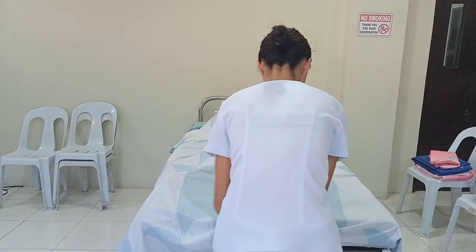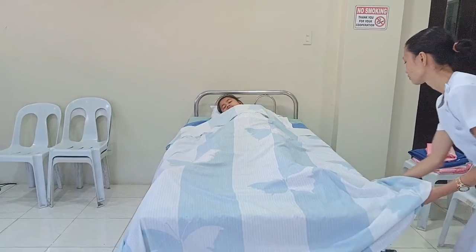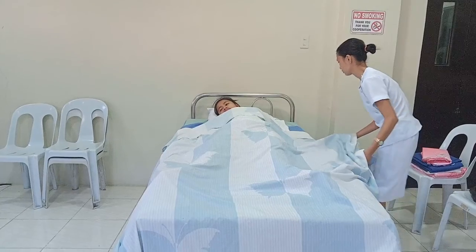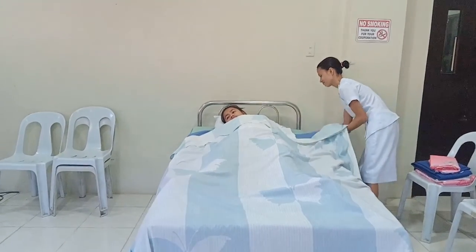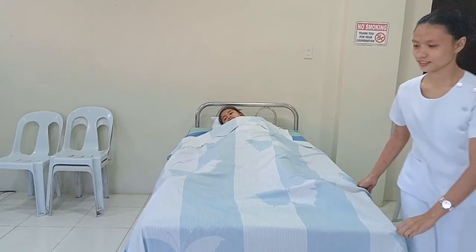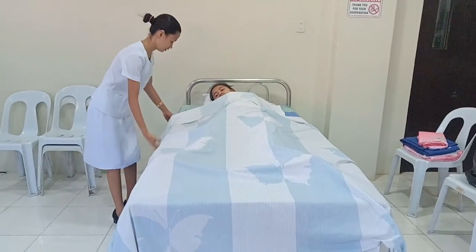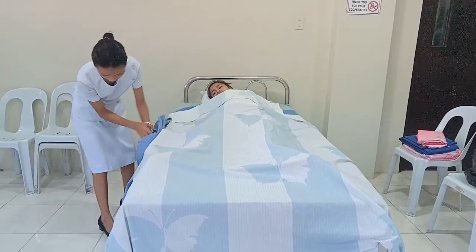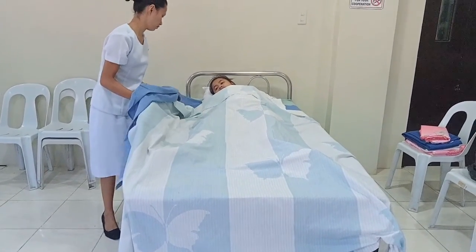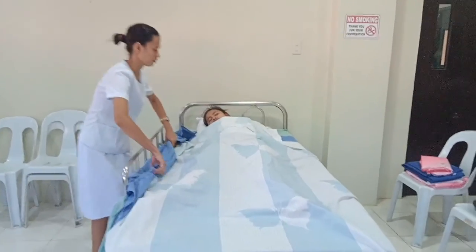The top sheet can remain over the client if it is being changed and if it will provide sufficient warmth, or replace it with a bath blanket as follows. Spread the bath blanket over the top sheet. Ask the client to hold the top edge of the blanket, reaching under the blanket from the side. Grasp the top edge of the sheet and draw it down to the foot of the bed, leaving the blanket in place. Remove the sheet from the bed and place it in the soiled linen hamper.